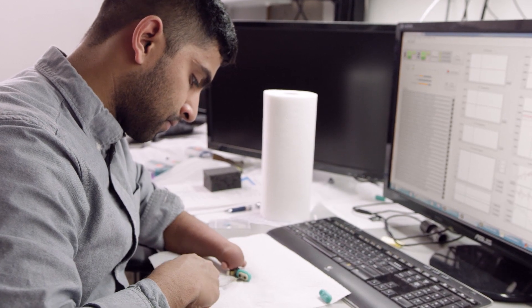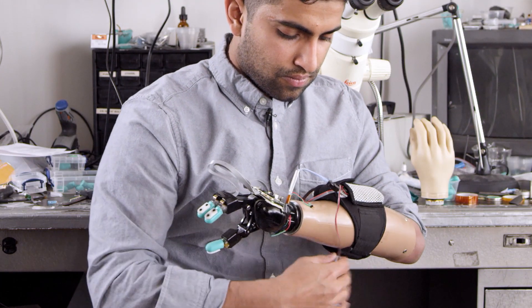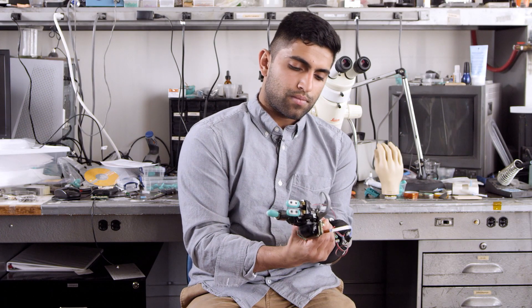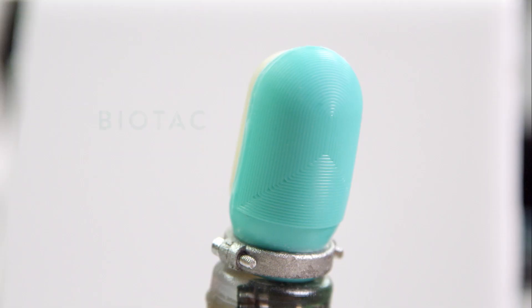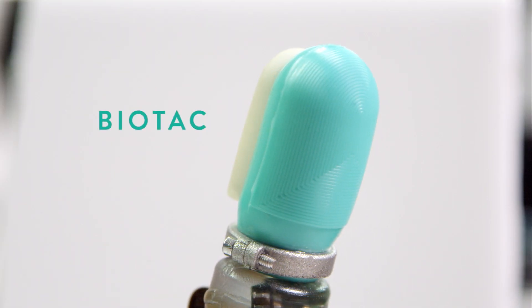My whole idea of the ideal prosthetic hand is one where you don't realize you're wearing a prosthetic hand, and it just functions as a hand. A robotic finger would be very helpful, specifically for me, just because it would make my prosthetic hand — which is essentially a dummy hand — smarter and more intuitive. The BioTac is a biomimetic tactile sensor modeled after the human fingertip.